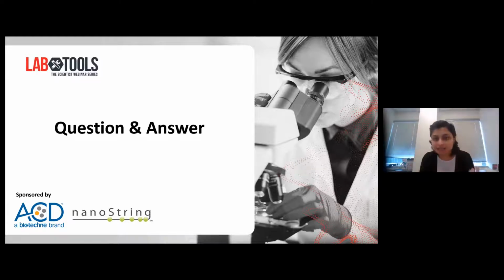Principally the assay is exactly the same. Chemistry is pretty similar. The only thing is, with this assay, we have introduced the iterative modality of detection, where it's cyclic detection. So you do 3 rounds of staining so that you have all the 12 targets on the same section of the tissue. That is the main difference. The probe design strategy and everything remains the same. The sensitivity and specificity are very much similar to our original assay.